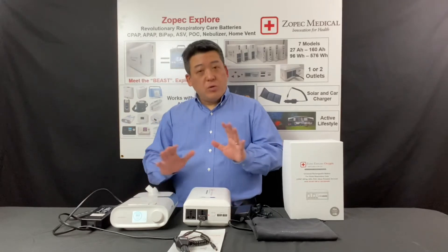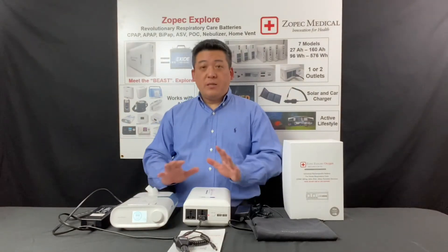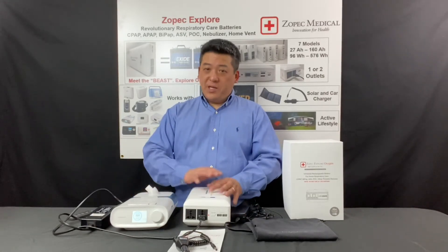Then slide the AC outlet switch to on and the red LED light will light up, indicating there is power to the outlets. The DreamStation powers up and the CPAP runs. It's that simple — no adapters needed, no worry. You just plug it in and it runs.